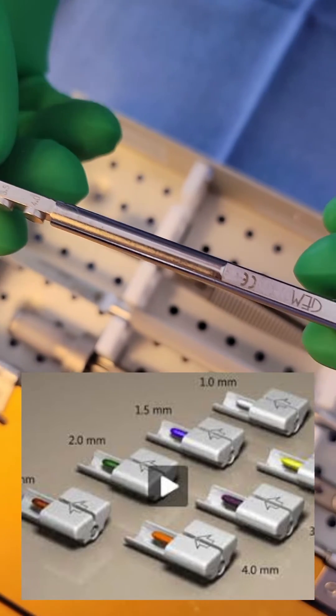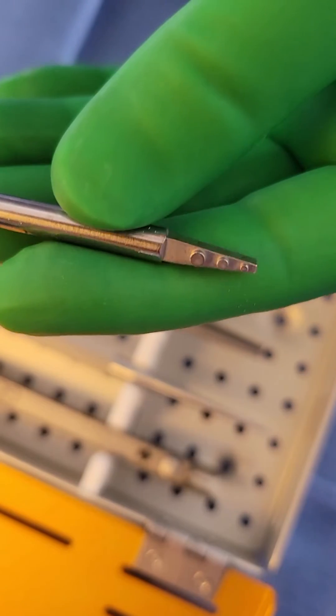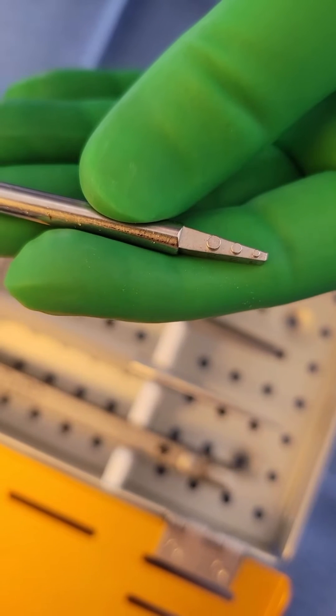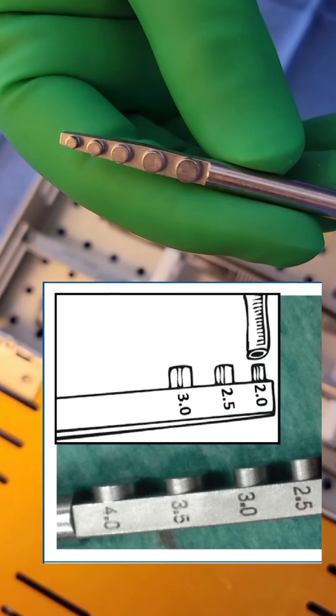As you can see it has numbers 2.0, 2.5, 3.0. It's very tiny and if I turn it over, you can see how they could very easily measure the diameter of the vessel with these dots.